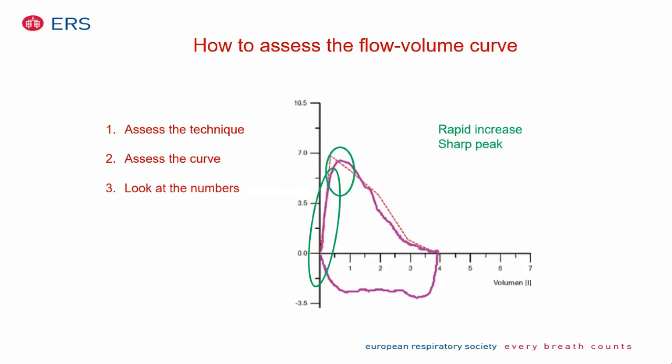So this lung function here is not very nicely done. You should have a linear curve that can be concave shaped. That doesn't play a role if it's done well or not, but it has not to have any waves inside. And then you can also have a look at the inspiratory loop. And then finally, you will look at the numbers.